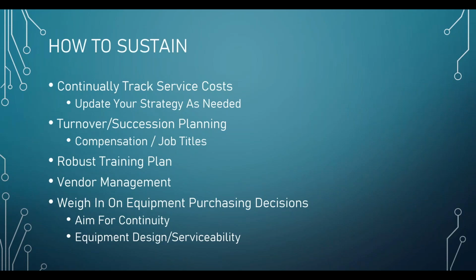There's another vendor of the big 3 that is kind of in the middle, and they'll let you download some of the service manuals, but a lot of them you can't get access to. And then the third one won't give you anything. They put up a complete wall. You can't even reload software unless you have a shared support agreement and get their key. So if I have a decision between these 3, why would I pick the one that doesn't give me anything? I don't like them.